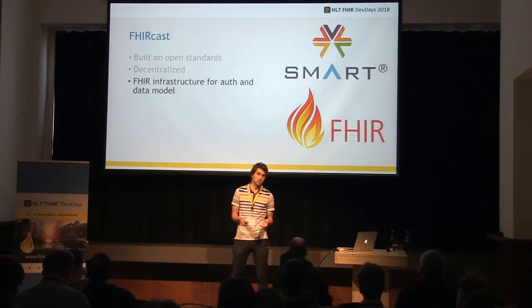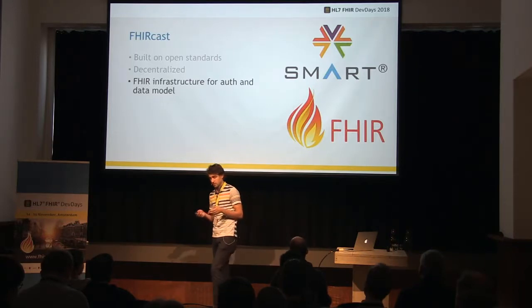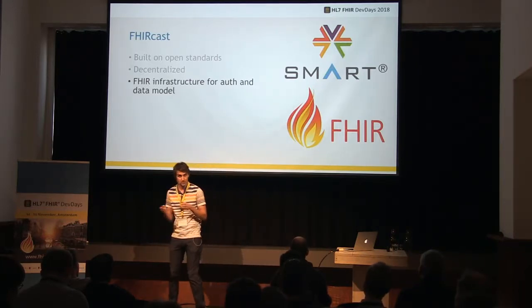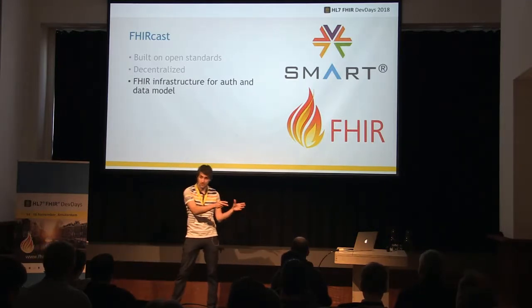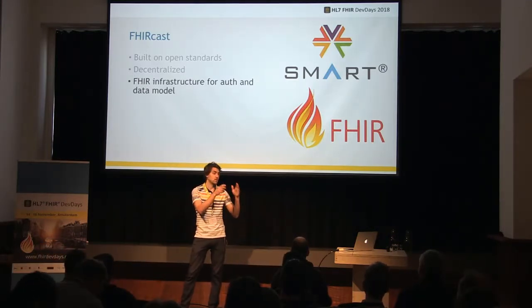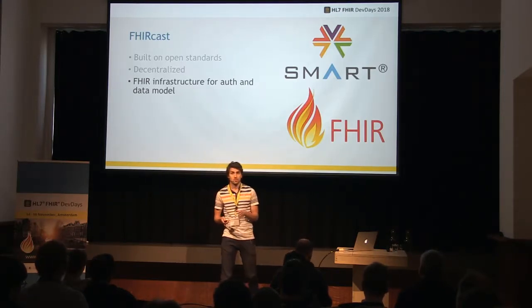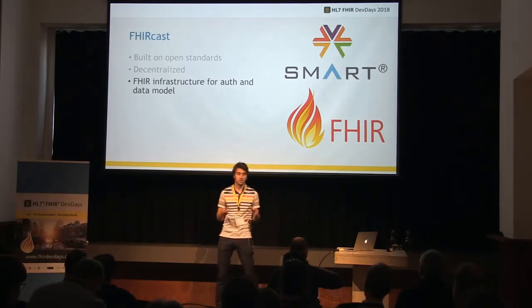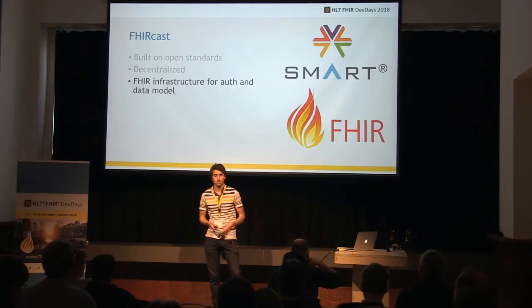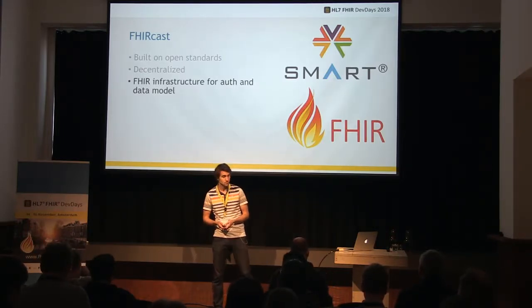And of course, it's built on good stuff that we all love. First of all, the data model for sending information back and forth, for saying that the context is now this, it needs to be specified, and of course it's specified using FHIR data models. So that takes some really heavy burden out of this specification, just leaning on all the work that we have in FHIR and all the rich data models we have there.